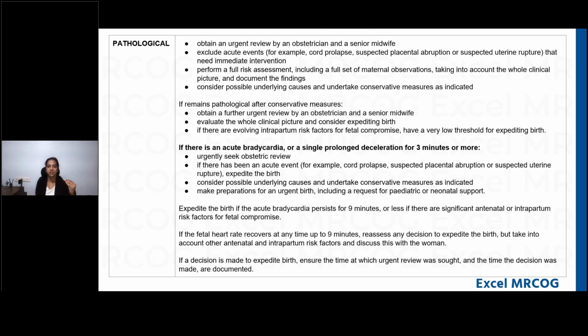Like you suddenly see that the patient is becoming hypotensive, and that may be the reason why the CTG is pathological. Please correct her hypotension. Please give her fluids. Please correct her dehydration. Okay. So you check for risk factors. You check for the overall clinical picture.